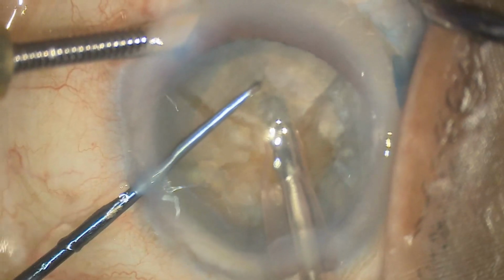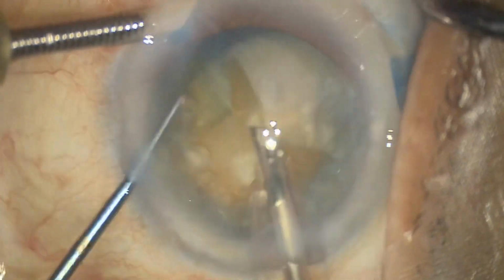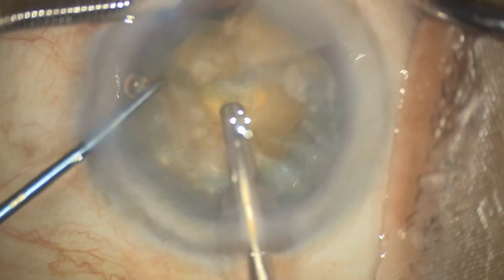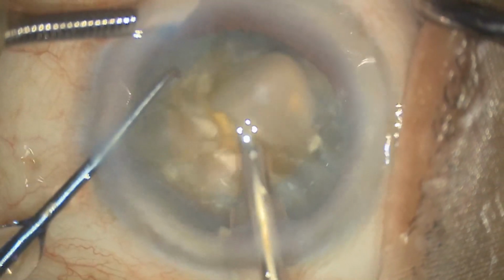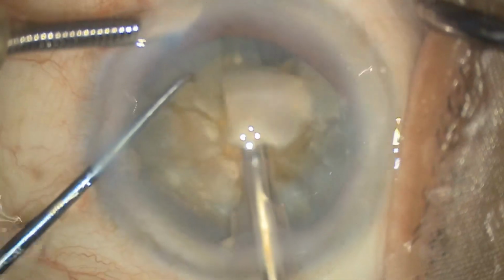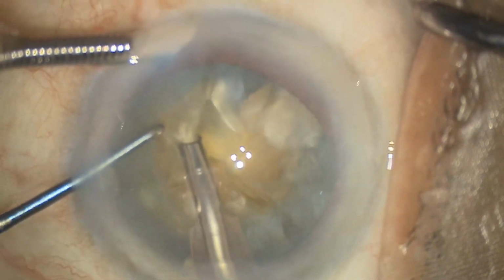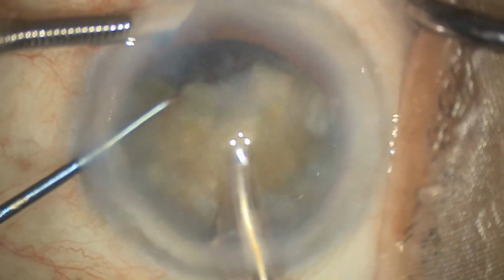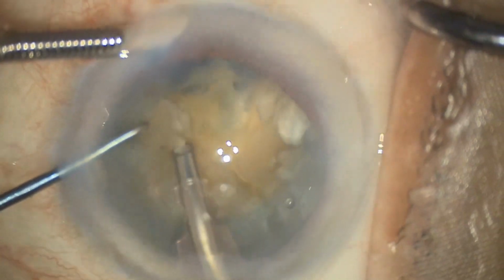Once you create 6 to 8 fragments of the nucleus, you start removing the fragments in fragment mode, and you bring the fragments to the center and emulsify the piece in the center.